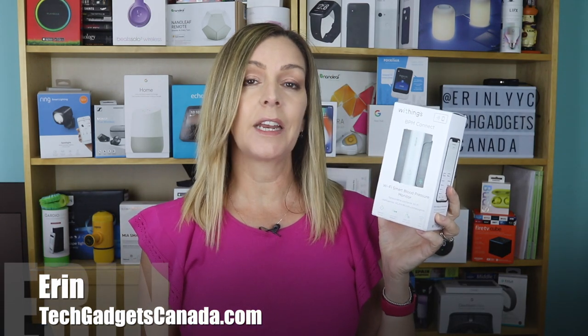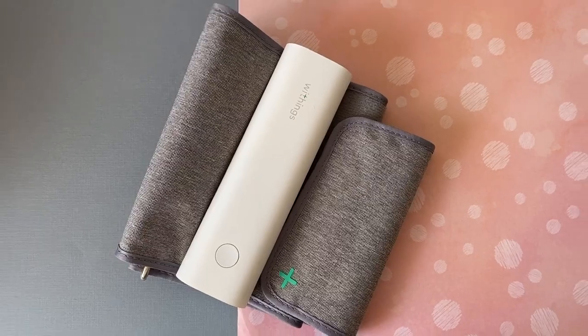I'm Erin from TechGadgetsCanada.com and Withings BPM Connect is an at-home blood pressure cuff that Withings claims is easy to use and highly accurate. Crafted with the help of cardiologists and cleared by the FDA, but as of filming time not by Health Canada yet, it makes taking your blood pressure and heart rate convenient and gives you immediate color-coded feedback on its easy-to-read LED display. It also connects seamlessly with the Withings Health Mate app on your phone. In this review, I will dig into what the device can and can't do, how it works, and whether I think it's easy to use.